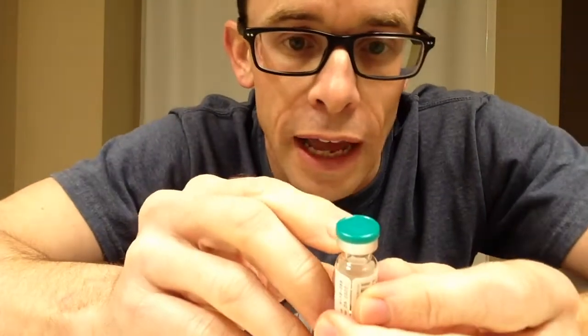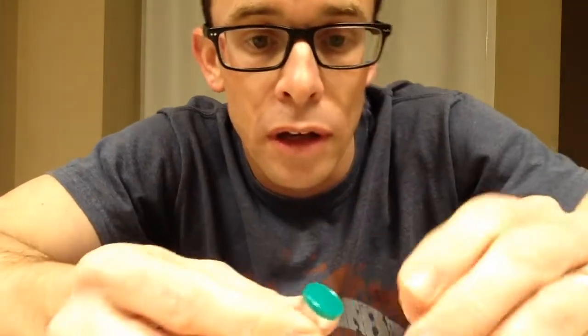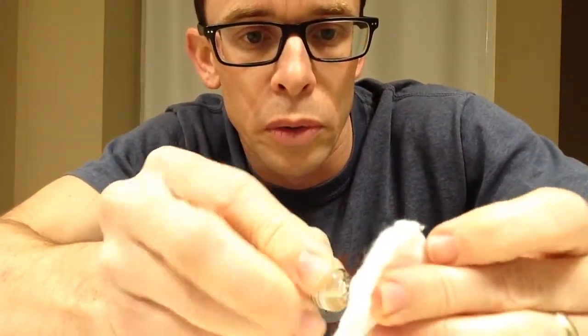So this green cap on top, that's just for protection. That just shows you that this hasn't been tampered with. So you take off the little green top. Then what you do is, I am not provided with the little alcohol swabs whenever I get my injection, and needles and things like that. So I just make my own, a little makeup pad here and alcohol. And so I just put a little on there. And then you wipe the top of this before you draw any out.